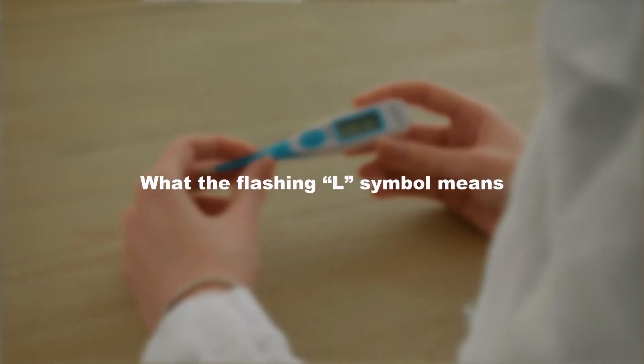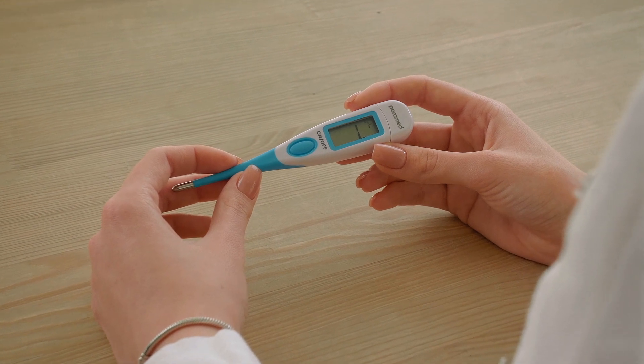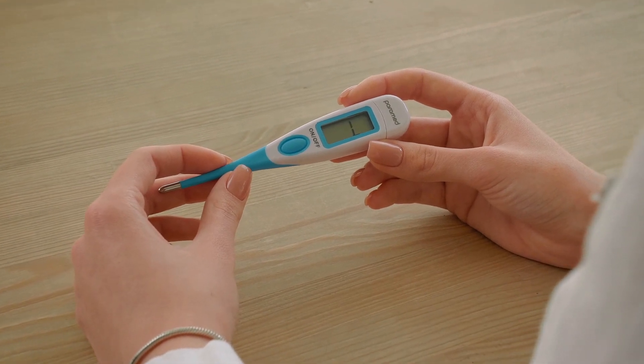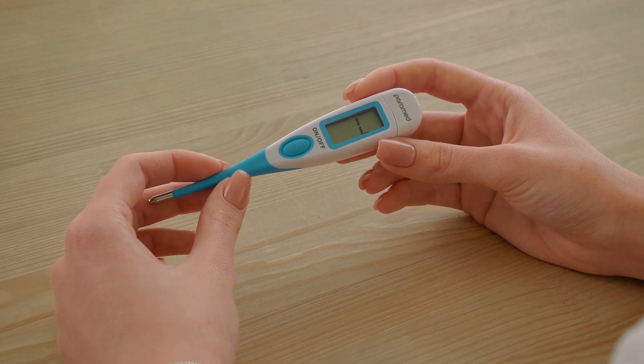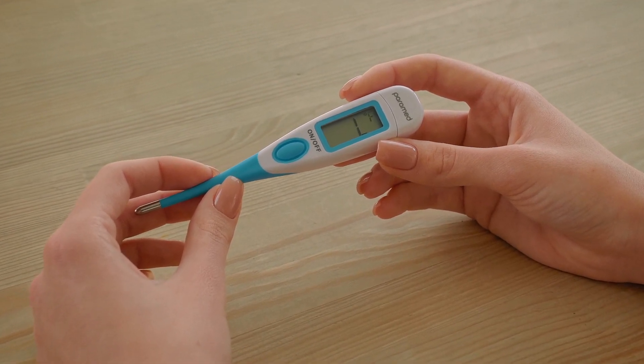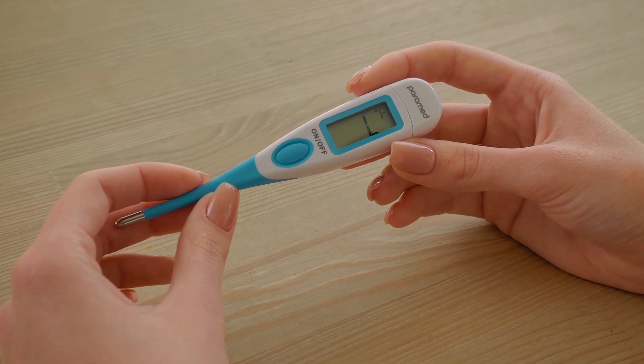What does the flashing L symbol mean? It means that the air temperature is not high enough for the thermometer reading — that is, it is below 32 degrees Celsius. This is not a low battery warning. It is just a sign to place the thermometer in a location where it will be able to measure the body temperature.